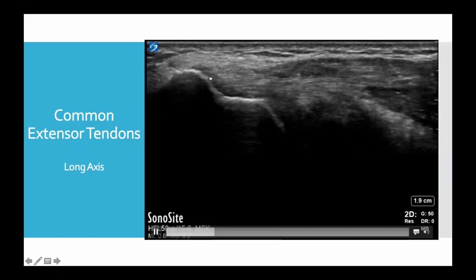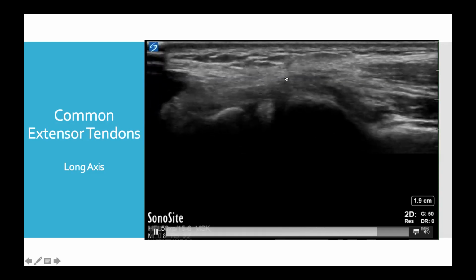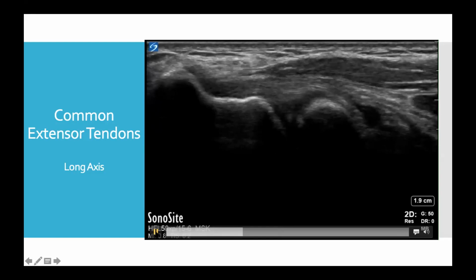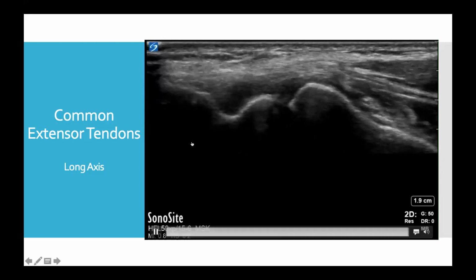What we want to pay attention to closely is this insertion point of our common extensor tendons onto the lateral epicondyle. This is included in this examination with this patient, even though we had a very high suspicion of the distal bicep rupture, to make sure we weren't missing anything or any associated injuries.